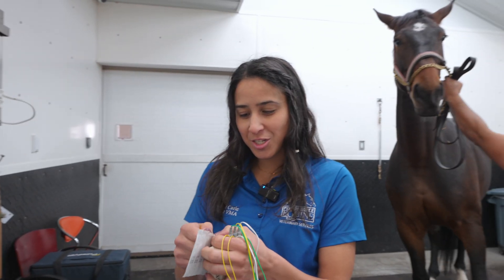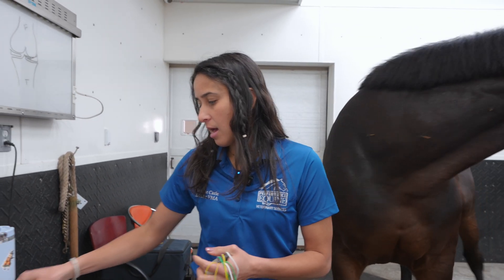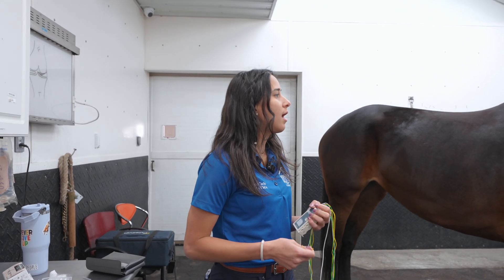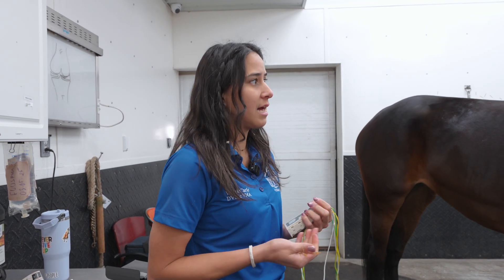Today we're going to do acupuncture on this beautiful young horse. This is the first time she's getting acupuncture and we're seeing how she's tolerating it. Since this is her first time she's a little bit antsy and moving a lot, but she's actually being really receptive with the needles, so that's good.